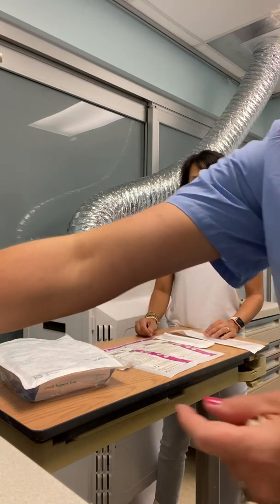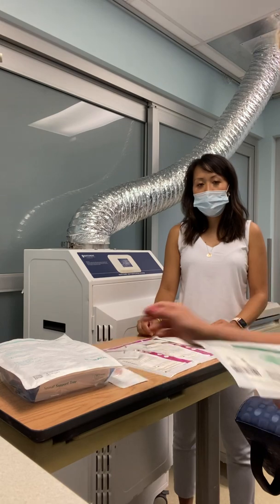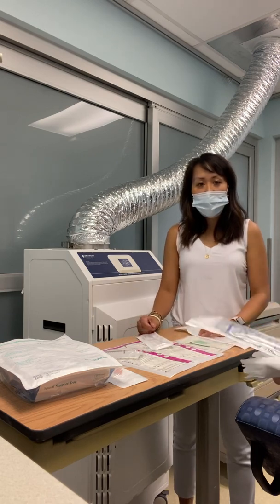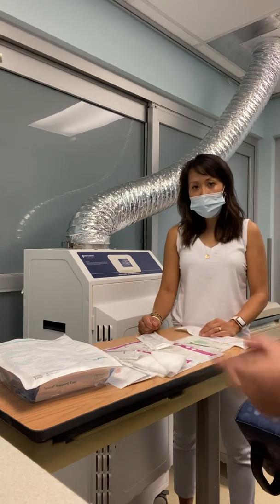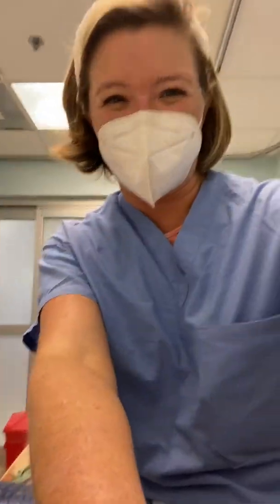Basically, you'll have the catheter kit and the needle itself ready for the provider. We also will get for the provider a ChloraPrep stick to sterilely prep the patient, extra Tegaderm, both for the ultrasound machine if needed, and the patient later on, some sterile gel for the ultrasound machine, and a little bit of gauze to clean up after it's all done. This is all you need to have ready before the provider arrives, and then we're ready for our patient to get here.